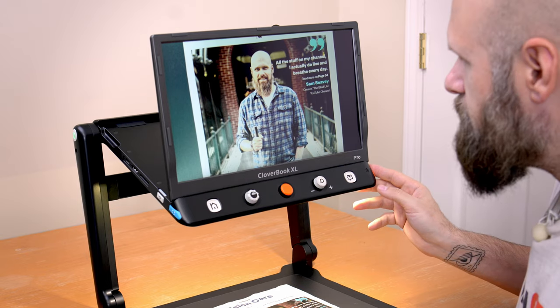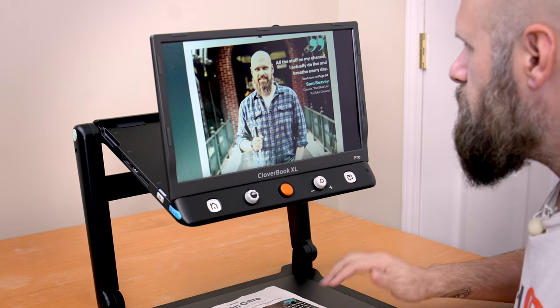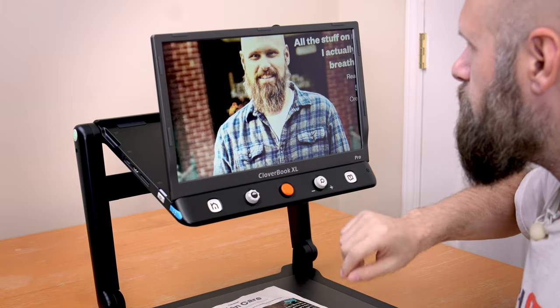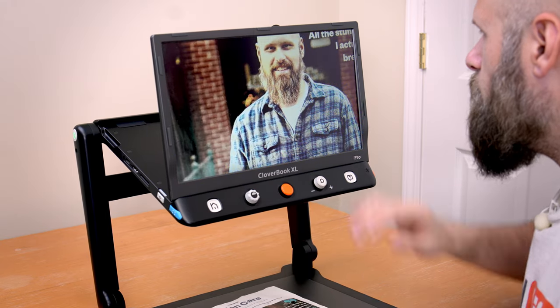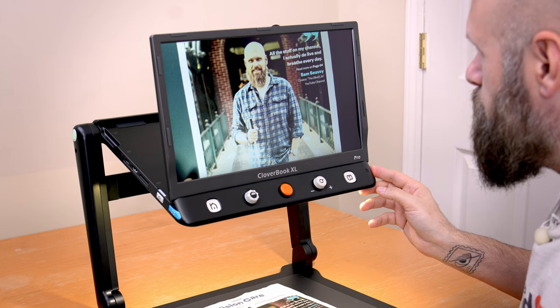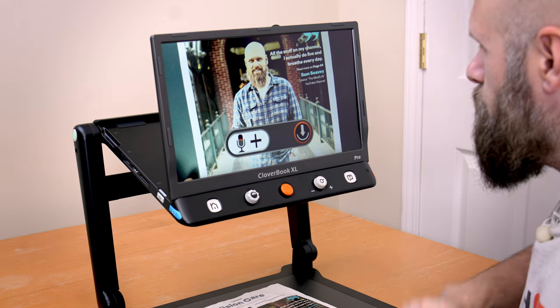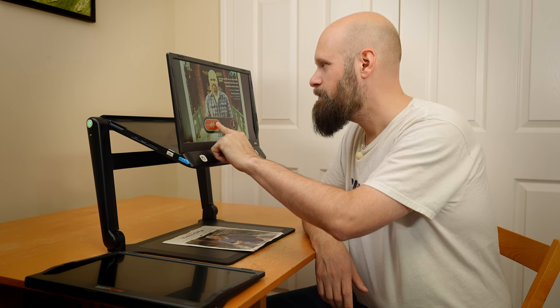Pressing the lower button on the right side takes a freeze frame — the image is frozen, and of course I can still zoom in, pan around with my finger or the joystick, and change my colors. If I'm in live view and long press the freeze frame button, it will save an image. I also get an option to record a voice message with the picture, and I can play that recording back.